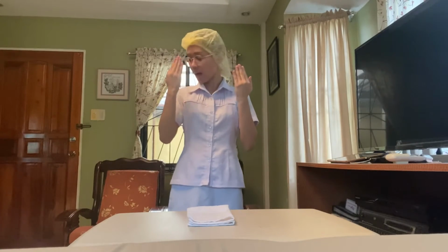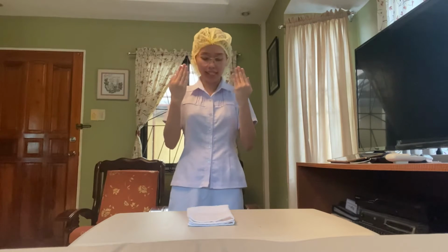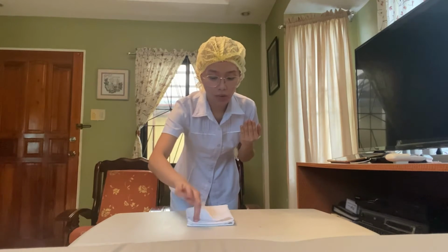First, make sure that your hands are above the elbow, between the axillary line and waist, and stand at 12 to 18 inches in front of the back table. Bend slightly at your waist and keep the elbows bent, and pinch and lift the towel using your right hand without touching or dripping the sterile field.